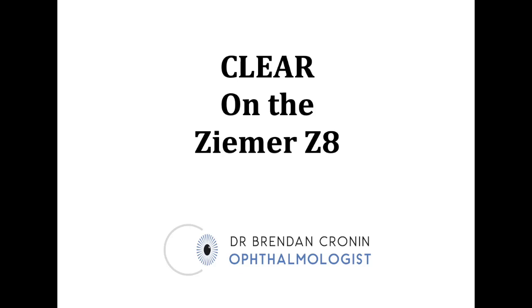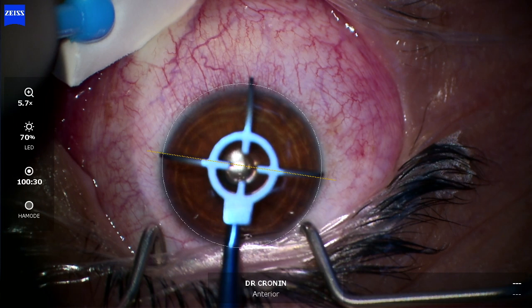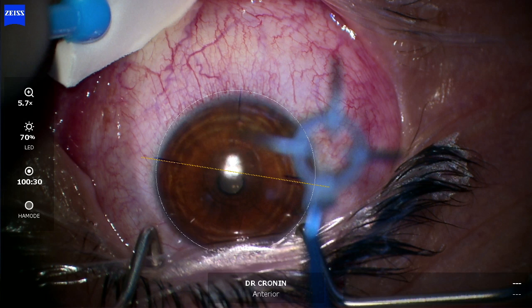This is CLEAR on the Ziemer Z8 laser, which is akin to SMILE on the Zeiss VisuMax. I've sped this video up to make it easier to watch. We align the eye with the rotational marker using the Zeiss Callisto system.